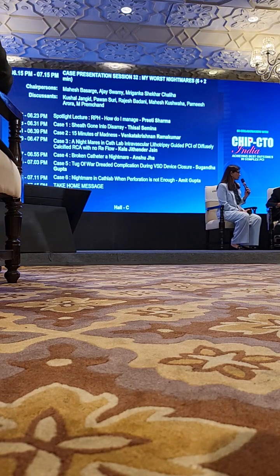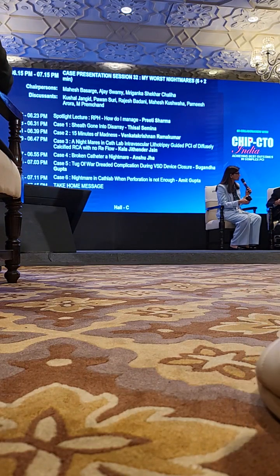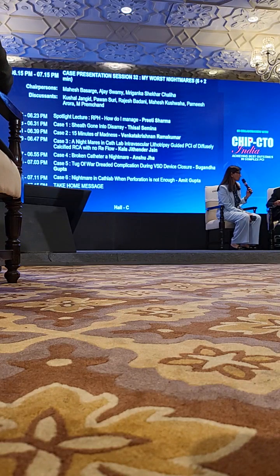But you put a cover. No, we took an 8 by 40 balloon. Yeah, it was inflated there. We waited, and when it could not seal the perforation, only then did we put in a cover. But you have to reverse the heparin. When you have such hardware, you cannot fully reverse the heparin. That is the catch. Once the procedure is over, you can reverse the heparin. No problem. You have the balloon in the femoral, you have the sheaths there. So you cannot fully reverse it.